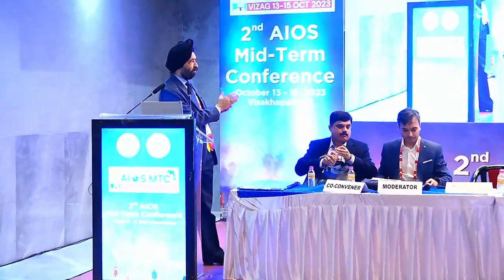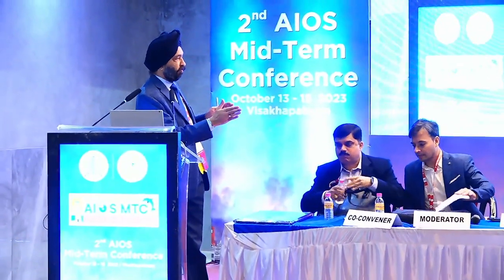So basically, that's what I'm telling the J&J guys: typically what you have is a 4 micron spot for Zeiss and a 4 micron separation. So that's for the plasma to expand. Here they are giving no space between 1 micron and 1 micron. So what I'm telling them, for a 1 micron spot, please give 1 micron separation. There is a technical problem in doing a line separation, but a spot separation can happen, and I'm going to start that pretty soon to see, because that will further reduce the energy level. Okay.